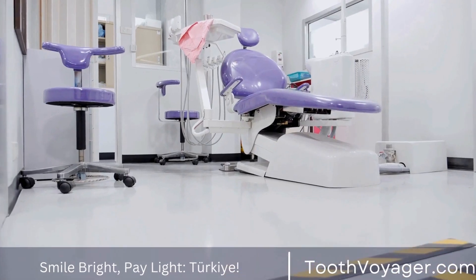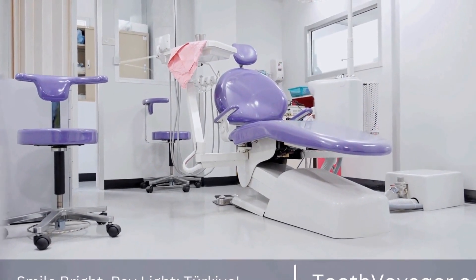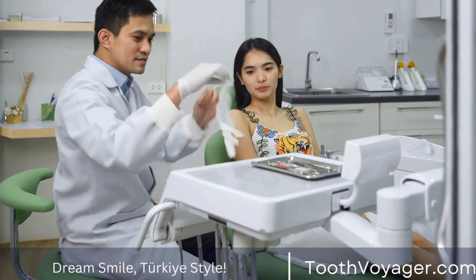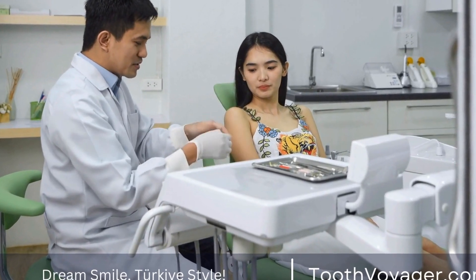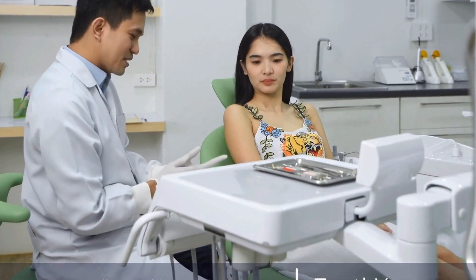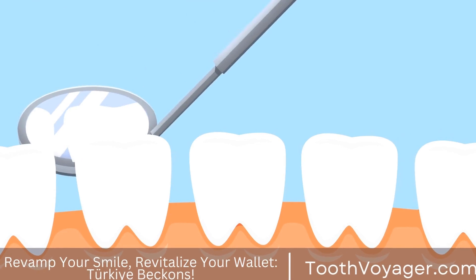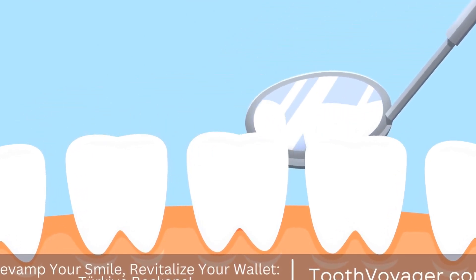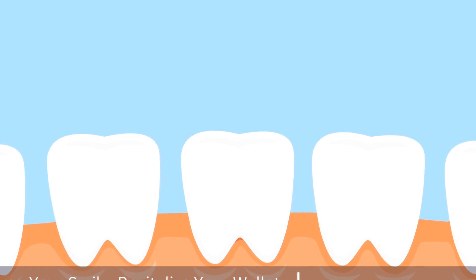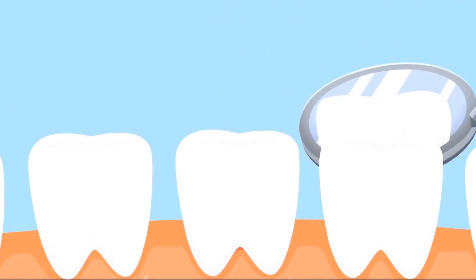Periapical x-rays provide a detailed view of the entire tooth, including the root and surrounding bone. Panoramic x-rays capture a broad view of the entire mouth, including the teeth, jaws, and surrounding structures. Cone-beam computed tomography, or CBCT, is an advanced imaging technique that provides a three-dimensional view of the oral and maxillofacial region, offering detailed information for complex treatment planning.